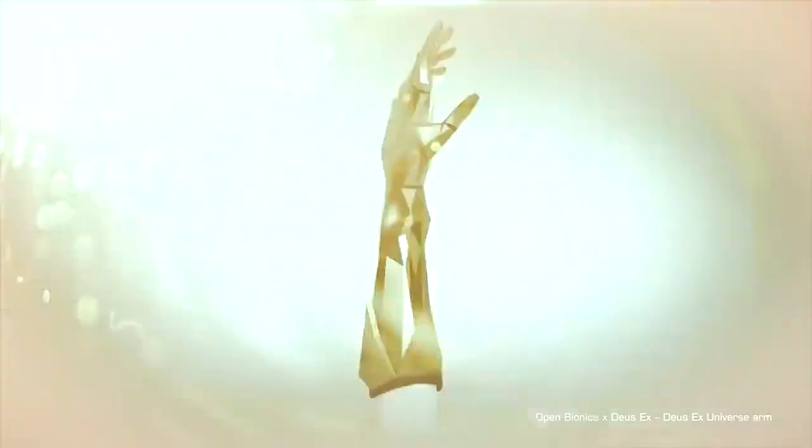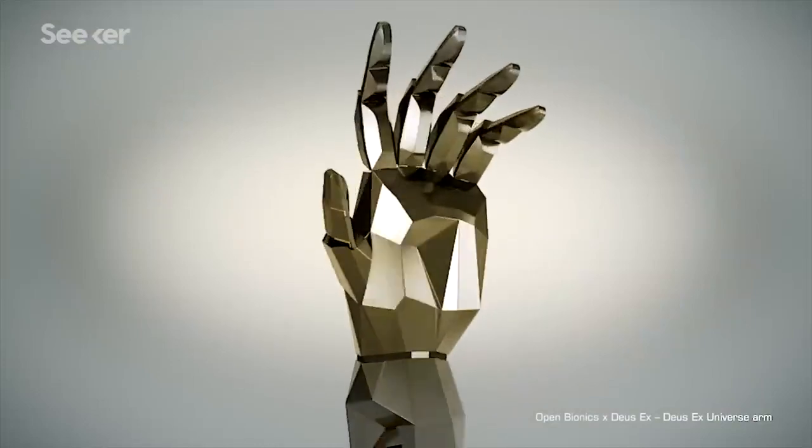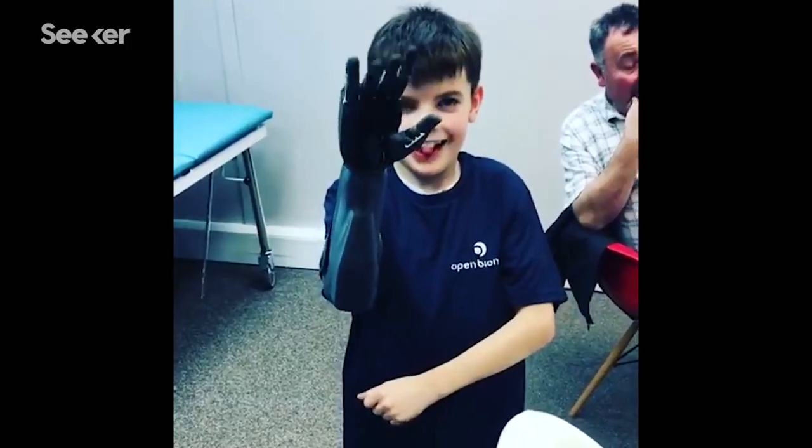Open Bionics is a Bristol-based startup and our mission is to create and democratize technology that enhances the human body. In other words, we turn disabilities into superpowers.